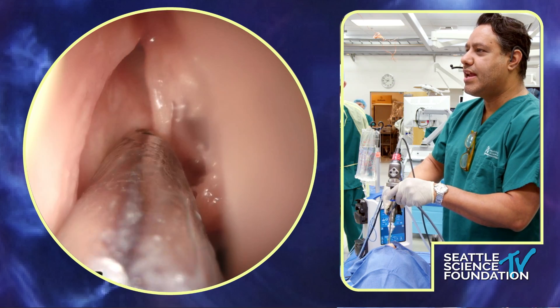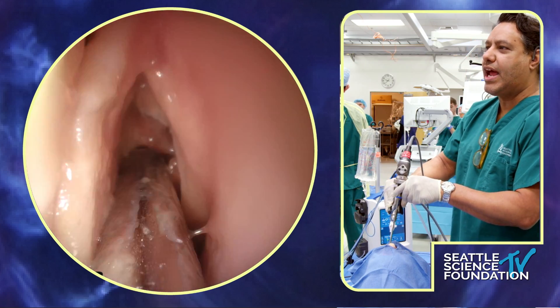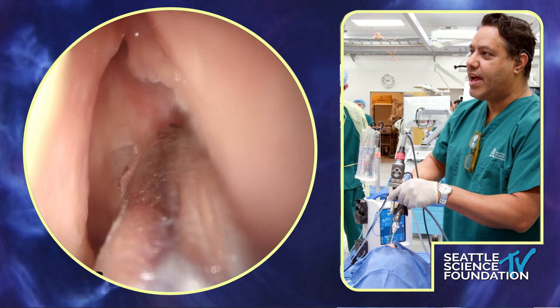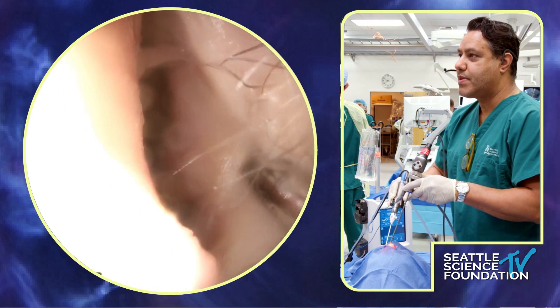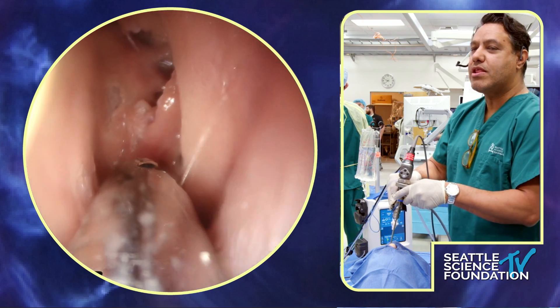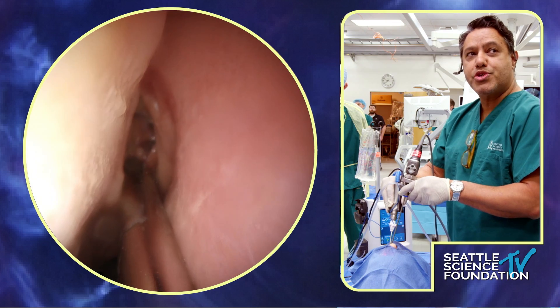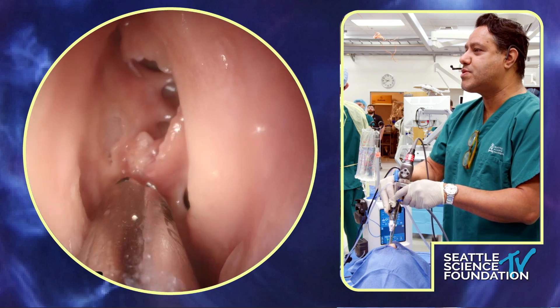One good wisdom on using the shaver: you want to be able to see the aperture at almost every moment. I don't want to use a powered instrument near critical structures without seeing much of the aperture. Once you take that bulla down, you can see the lamina papyracea in the lateral-most aspect. The trajectory of the medial wall of the orbit is from anterior-lateral to posterior-medial, so the orbit and skull base are going to find me once I get into the posterior-most ethmoid cells.